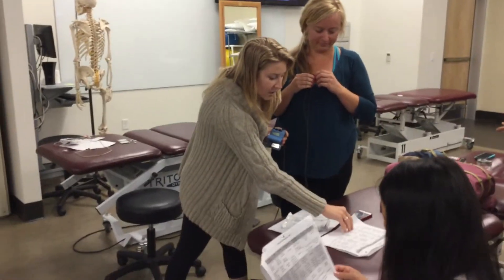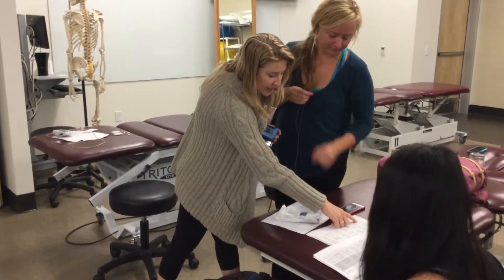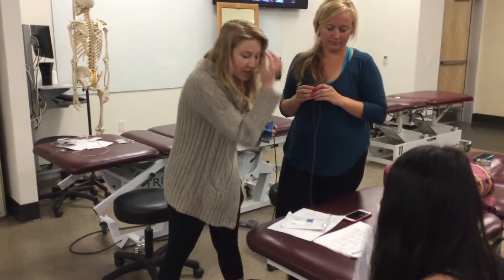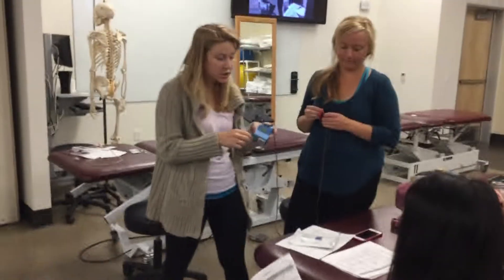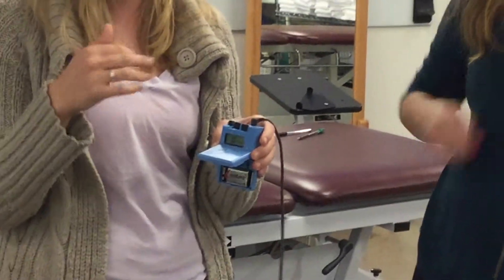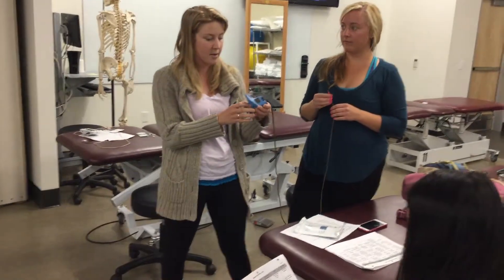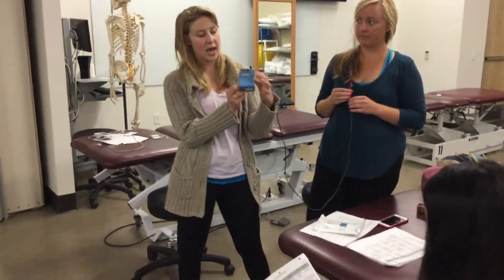On your sheet, it's going to be the very last one on page three: transdermal drug delivery. The first thing to look at is how deep the tissue is that you want to treat. If it's superficial, that would be 40; if it's deeper, it would be 80.